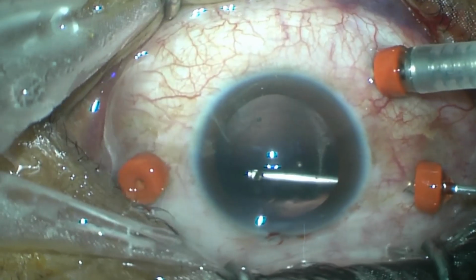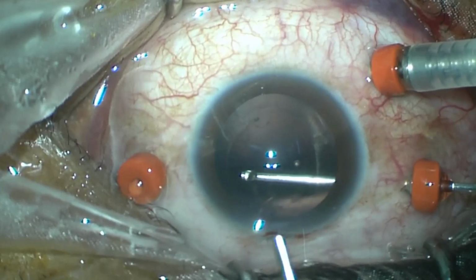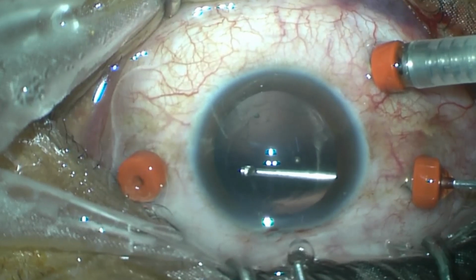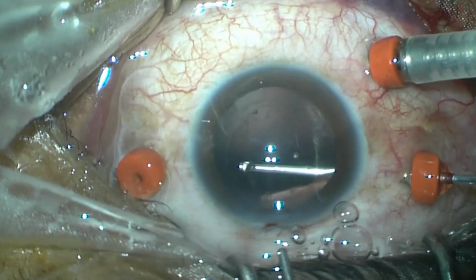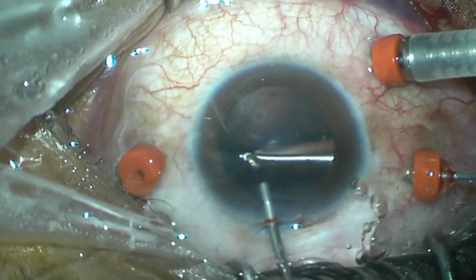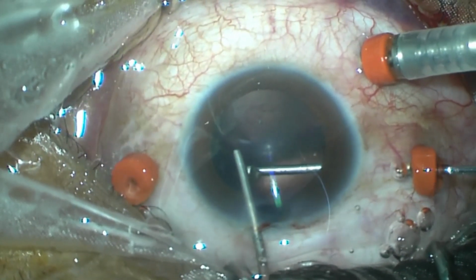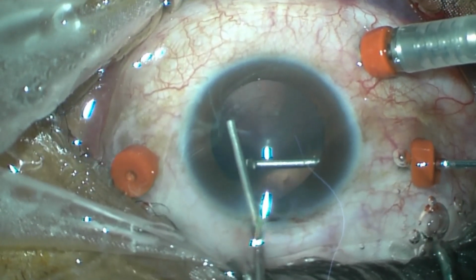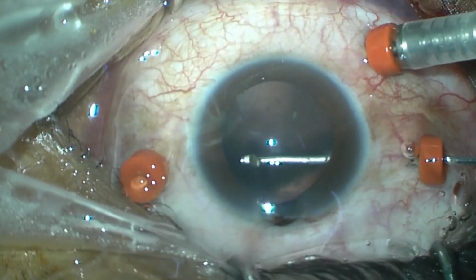So the light pipe has been disengaged, and now a foreign body micro forceps is being used to pick up this foreign body, which is held securely in the cutter port. And after lacerating the posterior capsule, we can reach up to the foreign body. Once you have switched off the irrigation, we need to form the anterior chamber using viscoelastic gel, and then we can switch to the foreign body forceps.